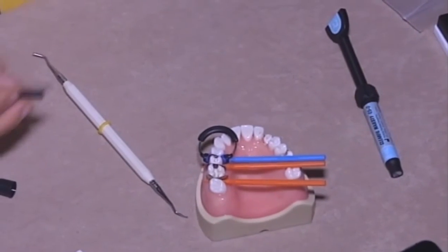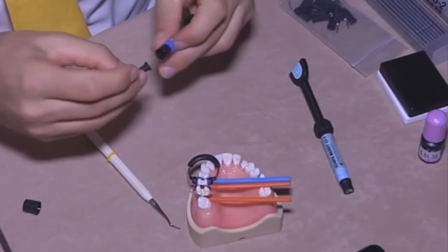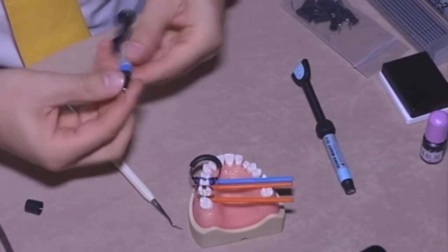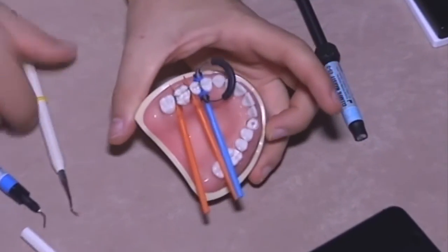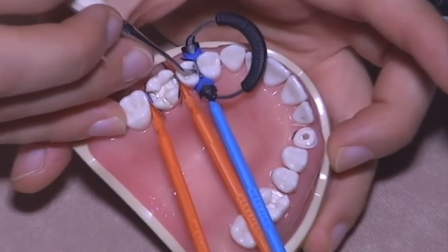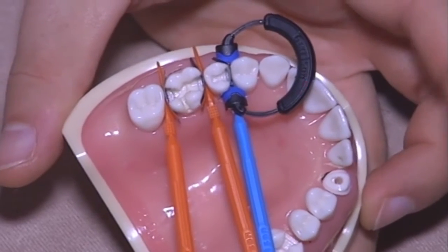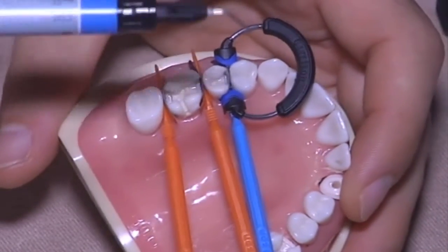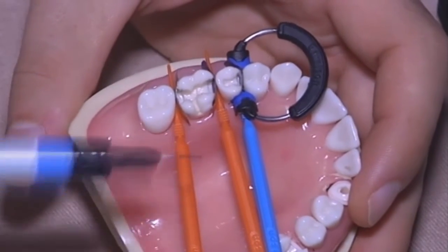You must apply a really thin layer, okay, 0.5 maximum. But first, if you have some little areas which are not perfectly closed there, the flowable composite will flow there and will seal perfectly even what you cannot see with your eyes.